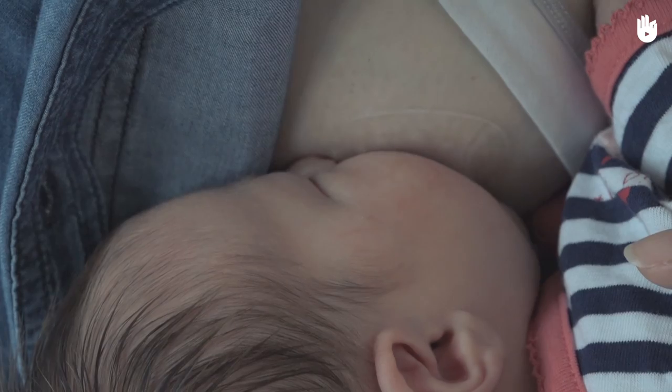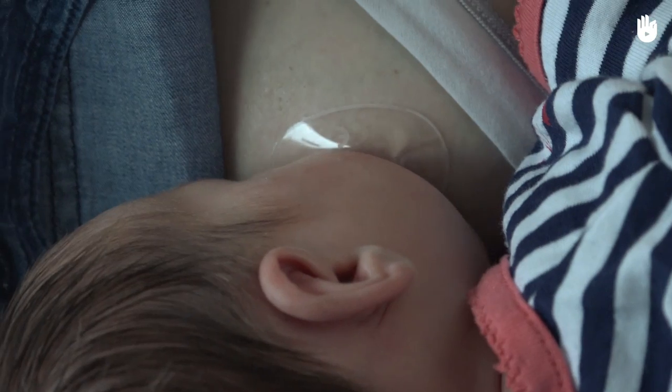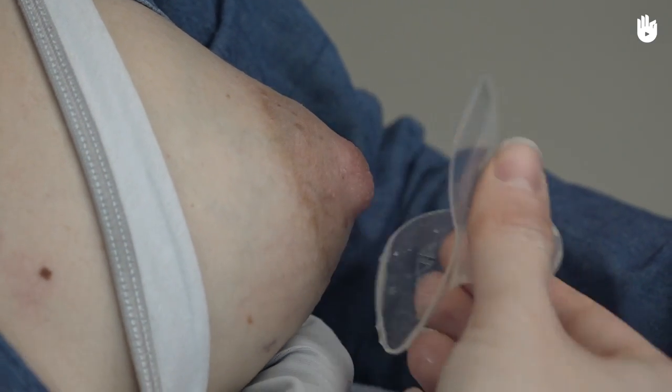The risk with nipple shields is a reduction in the production of milk, so they should only be used temporarily. To this end, try breastfeeding your baby without the nipple shield as soon as possible.